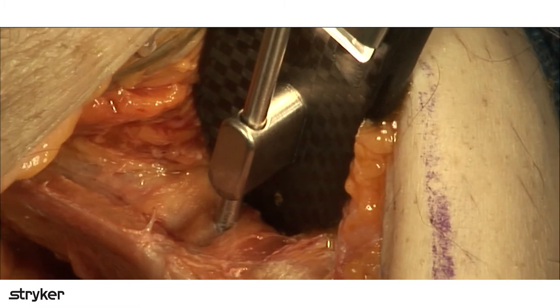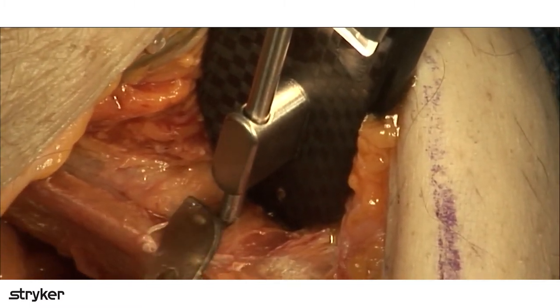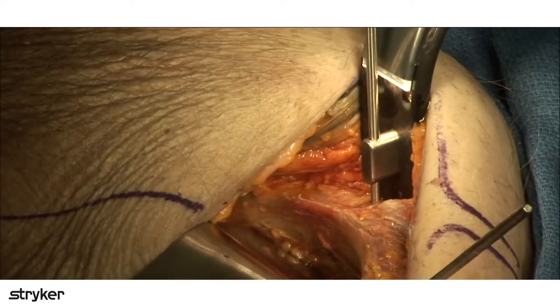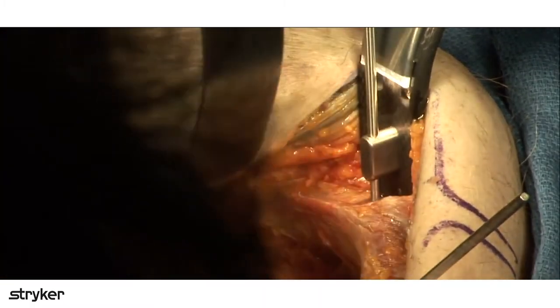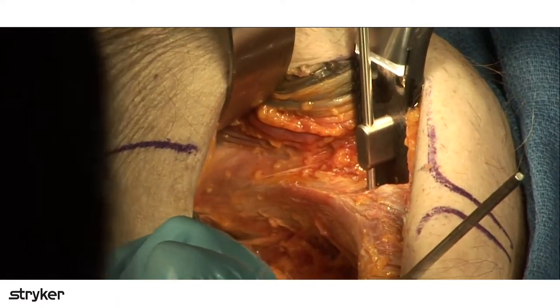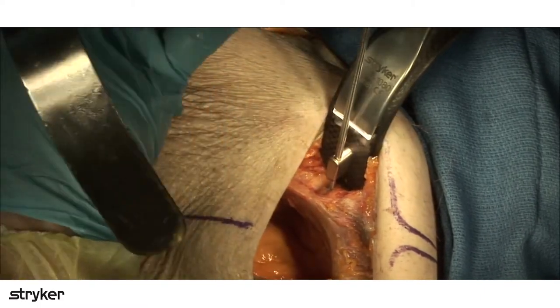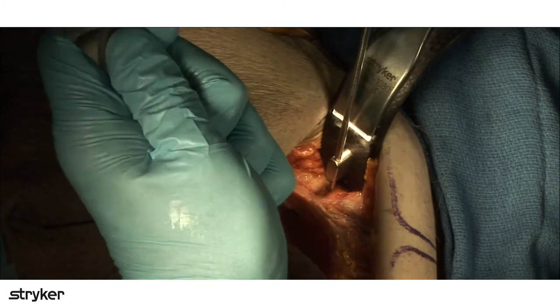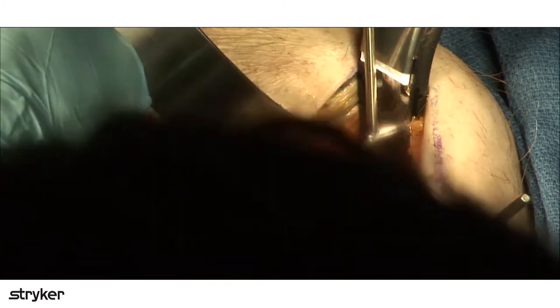All right, so you can see how we've got some pectineus muscle fibers here, and then now what we're going to do is we're going to work our way across the pelvic brim, and we're going to get ourselves up into the false pelvis. So right along here, if we take this retractor, I'll just show you, because there's a mistake that some people make in terms of what they think they're looking at. So there we go, that's a better view there.